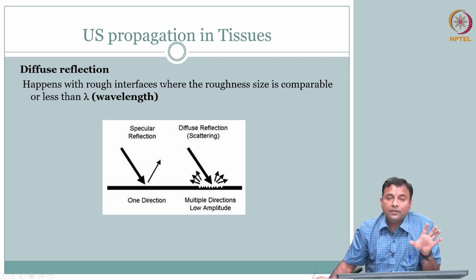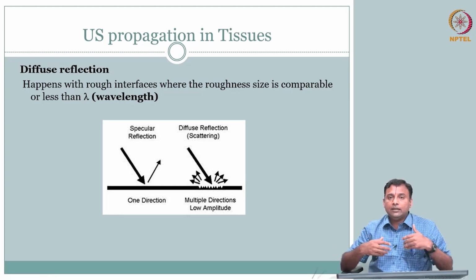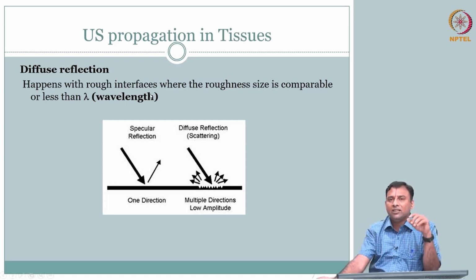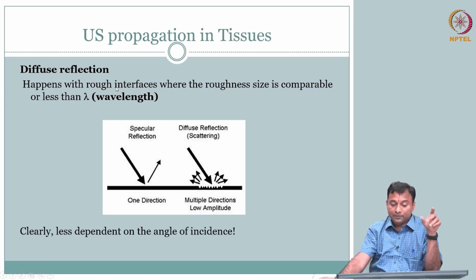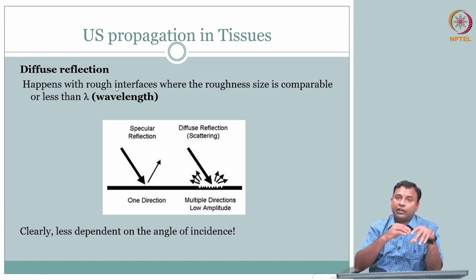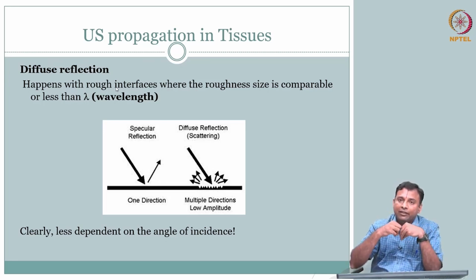So scattering is important, because when we talk about an organ, we talk about the outer interface that we considered when we calculated our R. Only specular reflection is okay there, but predominantly the object itself, the liver or all the tissue itself, you can think about it as having very small acoustic scatterers spread in the body.